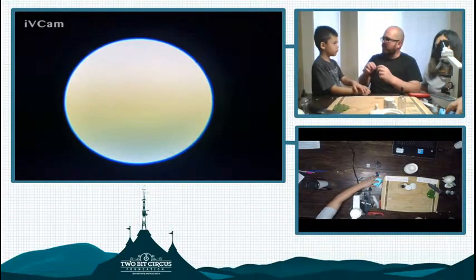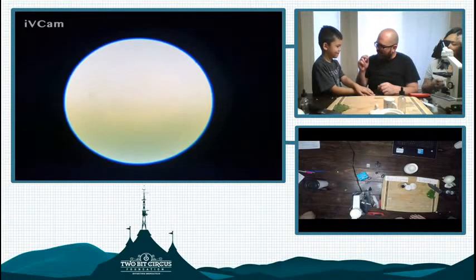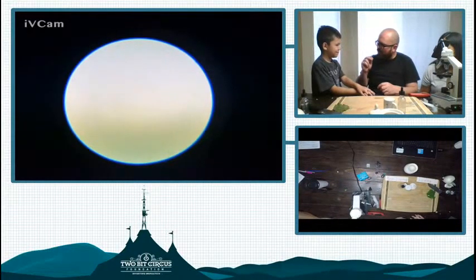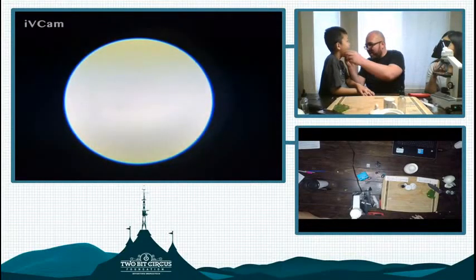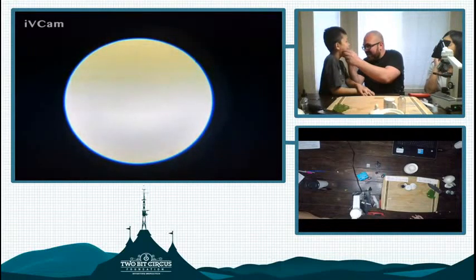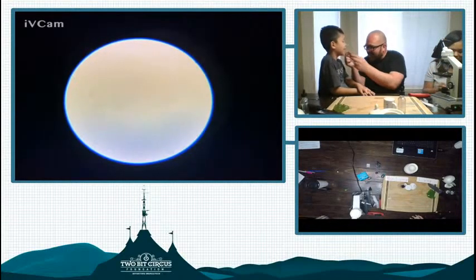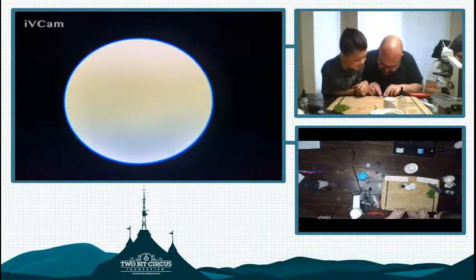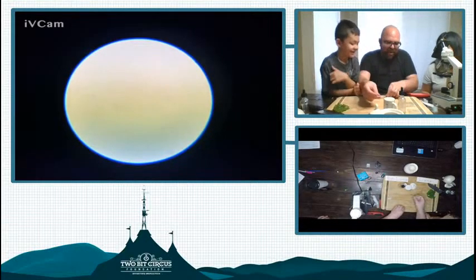Okay? And what we're gonna do, Robert, is I'm gonna take a sample from inside your mouth. And we're gonna check to see if there are cells inside the tissue of your mouth. You ready to do that? Okay, say ah. All right, let's see here. How's that feel, Robert? Feels funny? All right, let's check. Make sure you're alive in there. All right, and now I'm putting Robert's slimy, yucky stuff that I got from his mouth there.